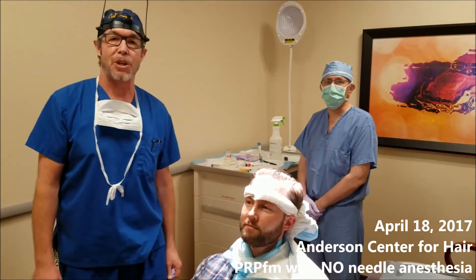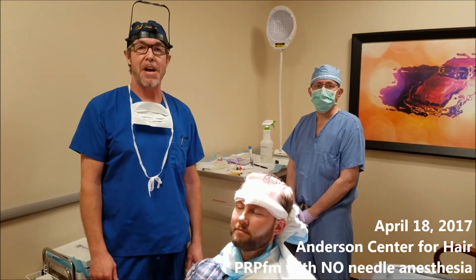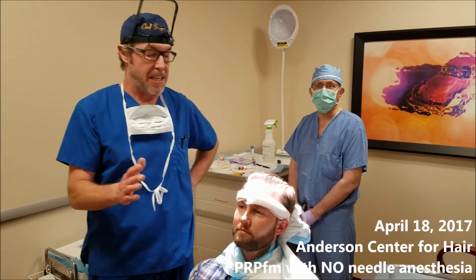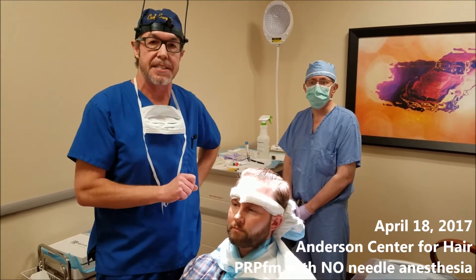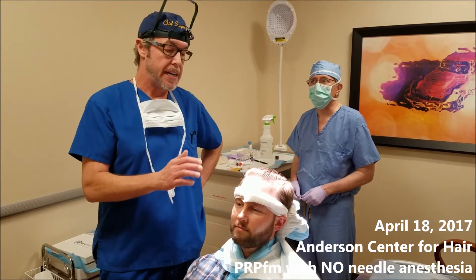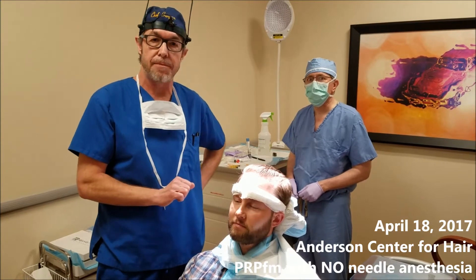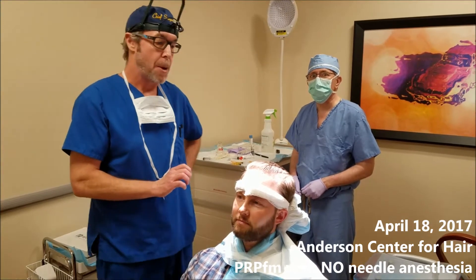My name is Dr. Ken Anderson. I'm here at the Anderson Center for Hair with Dr. Lee. Today we're going to do a PRP, but the big difference today is that we're not going to use needles to anesthetize the scalp. If you've had a PRP with me or elsewhere, typically what they'll do is take needles and inject the scalp so that the area above it is numb and the patient doesn't feel any pain.